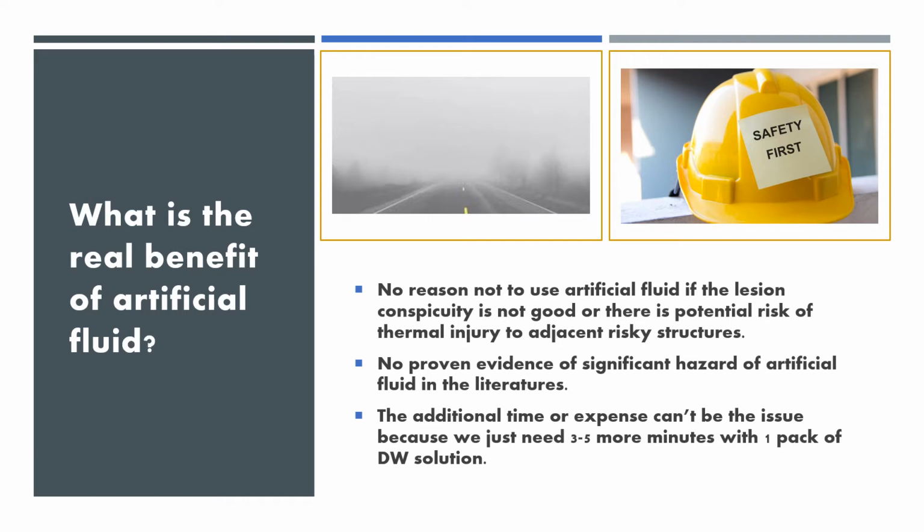What is the real benefit of artificial fluid? I think there is no reason not to use artificial fluid if the lesion conspicuity is not so good or there is any potential risk of thermal injury to the adjacent risky structures. There is no proven evidence of significant hazard of artificial fluid in the literature. Additional time and expense of artificial fluid cannot be the issue because we just need 3 to 5 more minutes with 1 pack of DW solution.